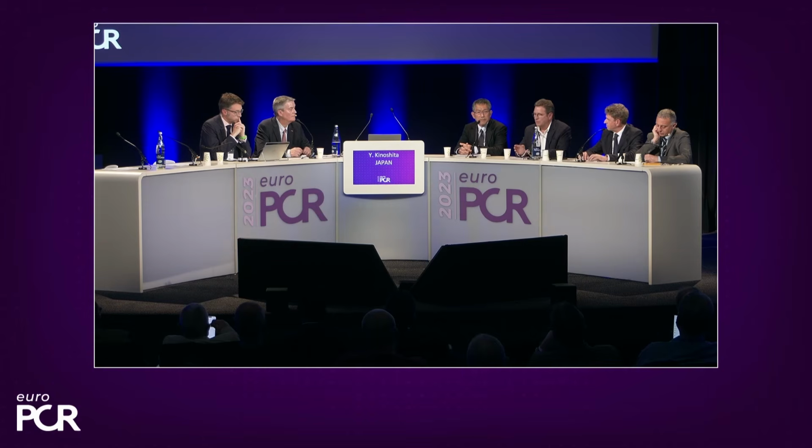Well, yeah, I'm totally agreeing with all these considerations here, but the fact is that we don't have the evidence. We are extrapolating from other situations and from the guidelines. And that actually emphasizes one of the things that we need to address as operators: keep the procedure simple if possible, do the best possible job, and check that we have really delivered the stent the way we liked. Because when we don't really have the evidence, we at least have the chance to do as good a job as possible when we go lower.